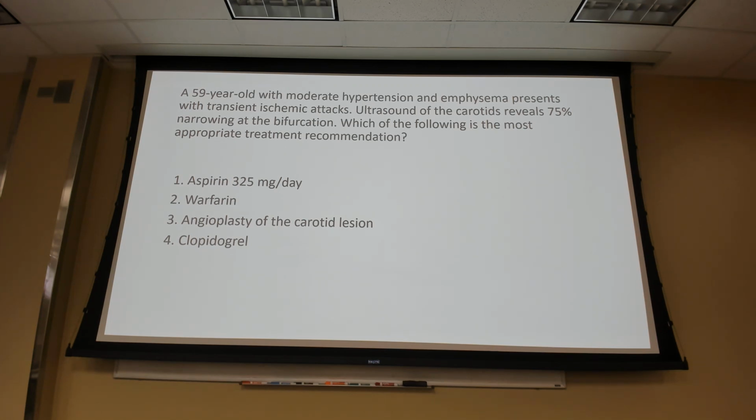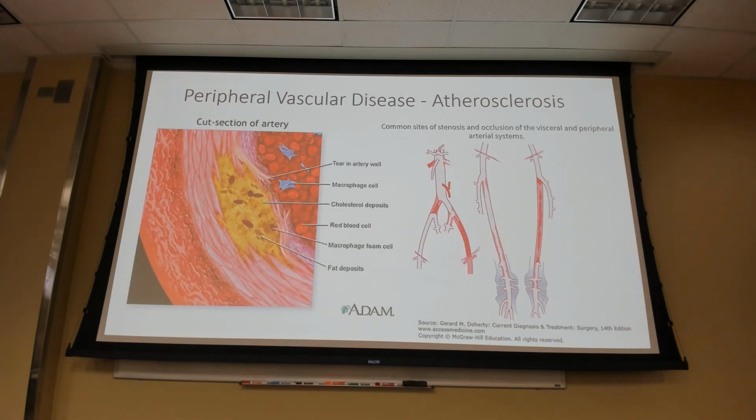And with the ultrasound, if the vessel is facing away from you, it's blue. If the vessel's coming towards you, it's red. So it's just a useful test we can use at the bedside. I don't remember which EMED block is all ultrasound scanning, so you guys will learn all about that, all about your friend's anatomy when you do that. But it's very simple and easy. Just click a button on there and you can evaluate that.